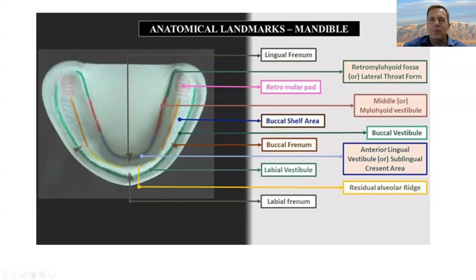Anybody who knows me knows I love implants. So my solution for mandibular dentures is to place some implants, but I know you can't always do that. And the retromolar pad areas. I know those are difficult to capture, but in the laboratory, especially for a double arch case, we're going to set the anterior aspect of the occlusal plane even with the incisal edges of 8 and 9. But the distal aspect is put halfway up the retromolar pads. So if we can't see the retromolar pads, it makes it difficult to get a good setup. So picking that up is really good.